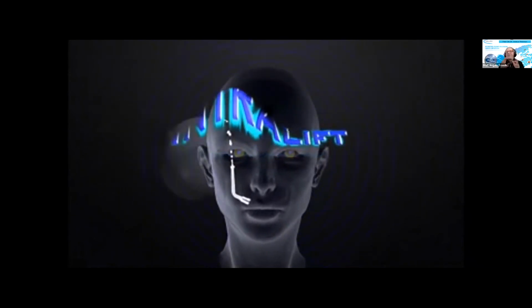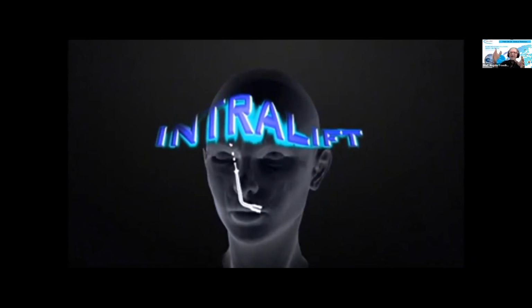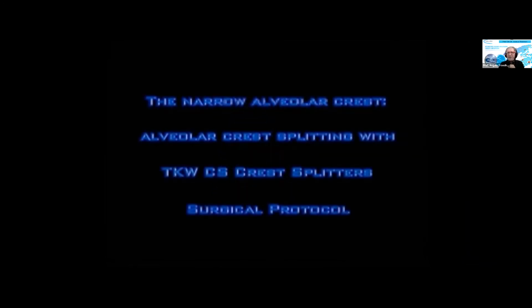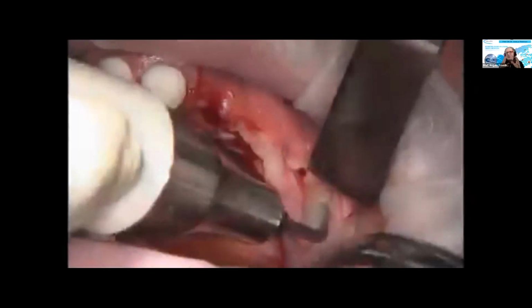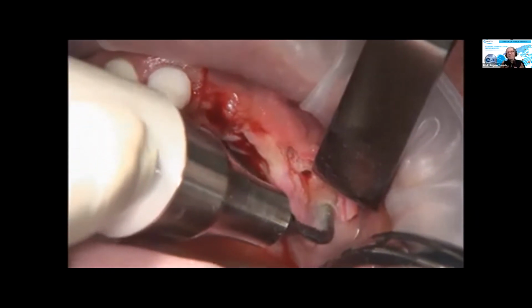So what we have to do here is, instead of doing autologous bone block grafting and lateral approach sinus lifting, which of course you could do simultaneously, but which is, let's say, with the traditional methods, very prone to big failures because it's just a too big surgical site, we do here a minimum invasive procedure.